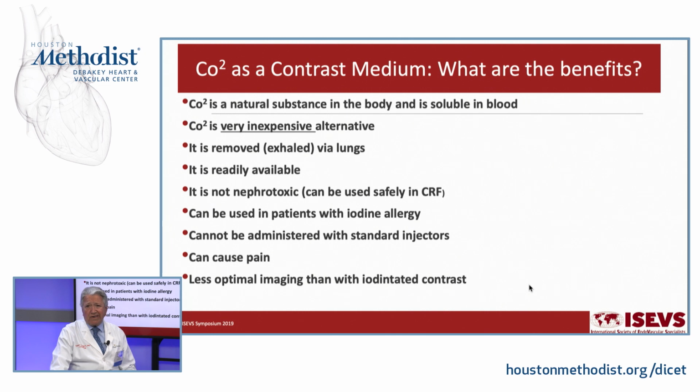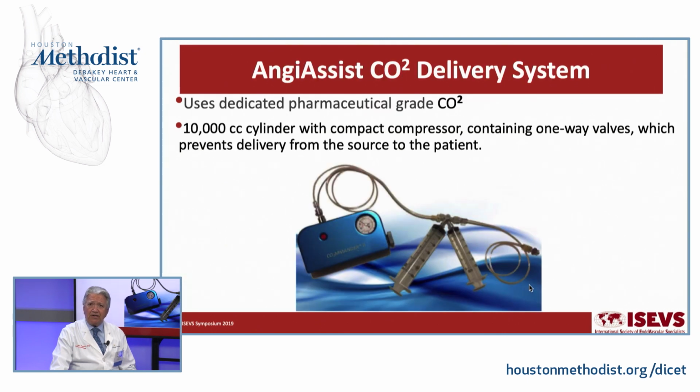But also it offers less quality image than iodinated agents. Now, what is extremely important is that CO2 can only be used below the diaphragm, in the abdomen, pelvis, and lower extremities, and it cannot and should not be used in the thoracic aorta or coronary arteries or cerebrovascular circulation.